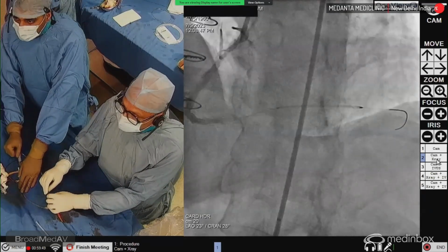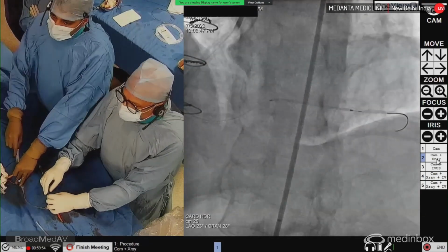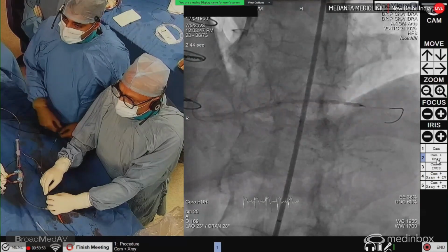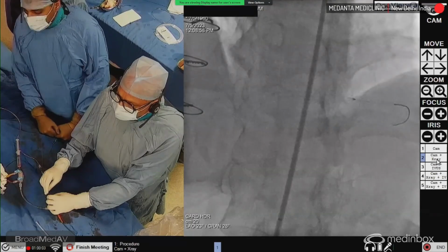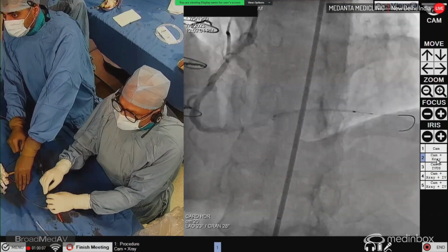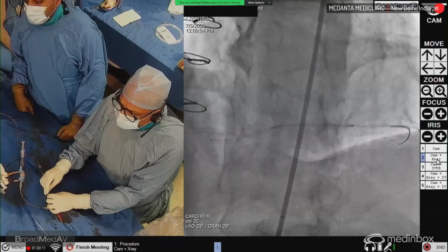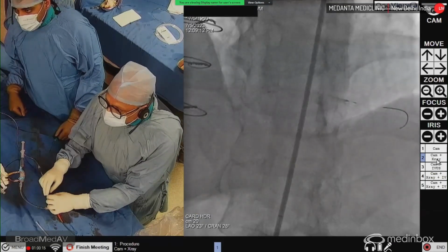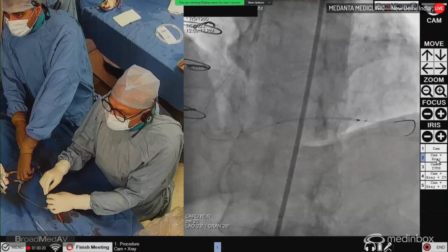Check, please. We are leaving that area. Distally, we're okay. Are we okay distally? Not covering the whole. Yeah, no, it's okay. We can bring it a little bit back. Okay. Check, please. It is just the right size. Just a little bit here and there, and that's it. It's absolutely cut to cut size, you know. Yeah, check, please.